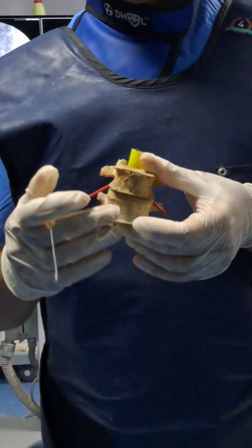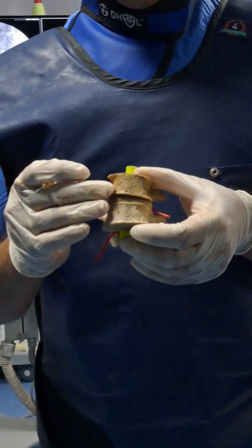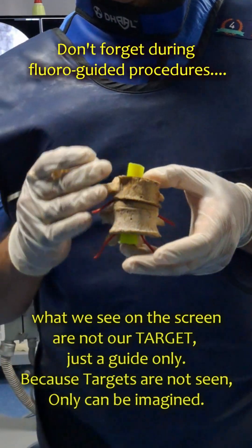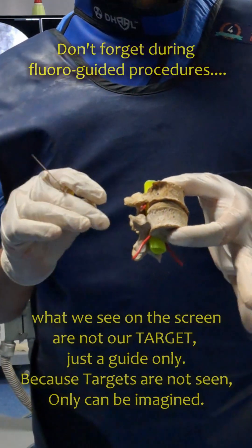Because we cannot see all the structures in fluoroscopy — we can see only the bones — your anatomy knowledge has to be so sound that you can visualize the structures which are not seen. The structures visible in the fluoroscopy are not our target, they are just a guide.